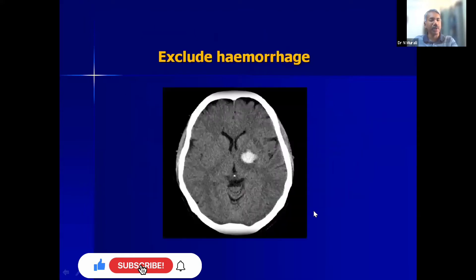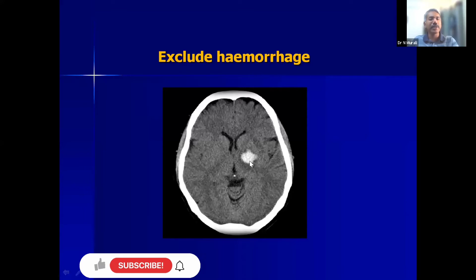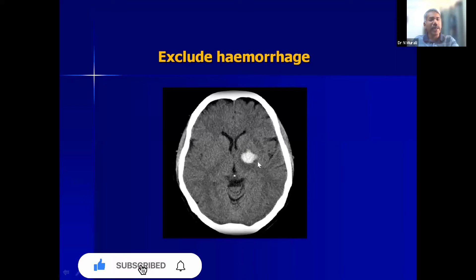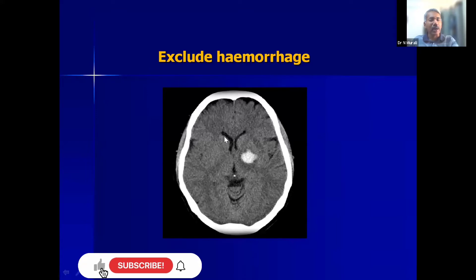Normal gray matter has around 40 Hounsfield units (HU), white matter has 25 HU, while hemorrhage is 80+ HU — very easy to identify. When hemorrhage is seen, interventional radiologist involvement for stroke management is not needed as it will be managed conservatively. The most common location for hypertensive bleed is the basal ganglia — including the caudate nucleus, lentiform nucleus, and thalamus — where small arteries rupture when blood pressure is very high.